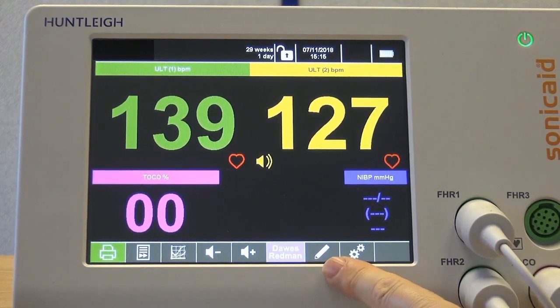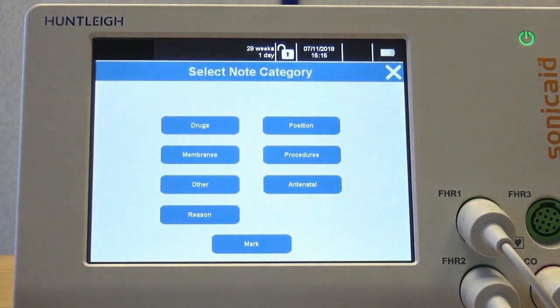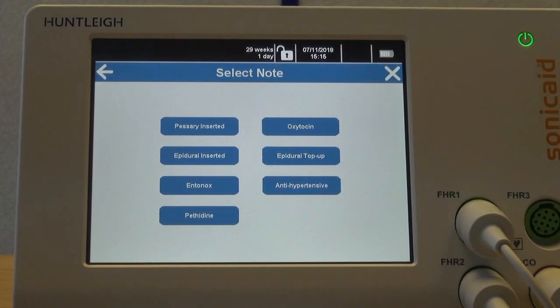Easy notes allows the trace to be annotated with predefined messages, organised in up to 12 categories and up to 12 messages in each category. There is also a mark button which marks the trace, allowing a handwritten note to be added later. All categories and messages are fully customisable.